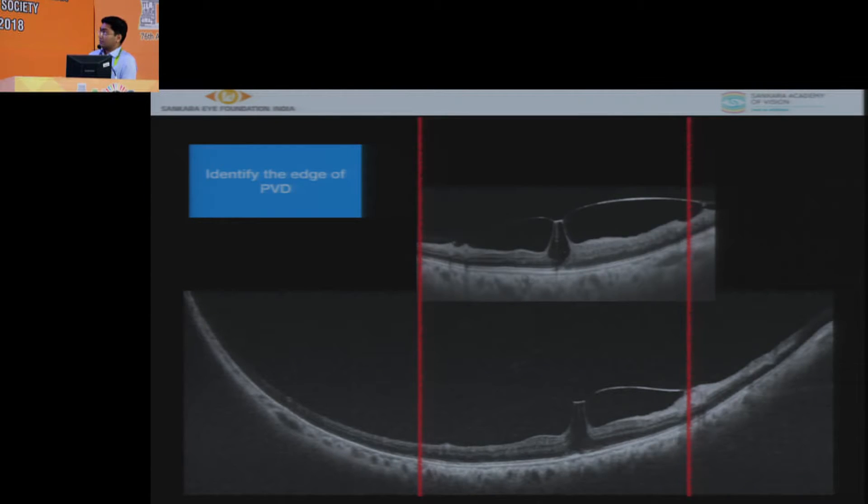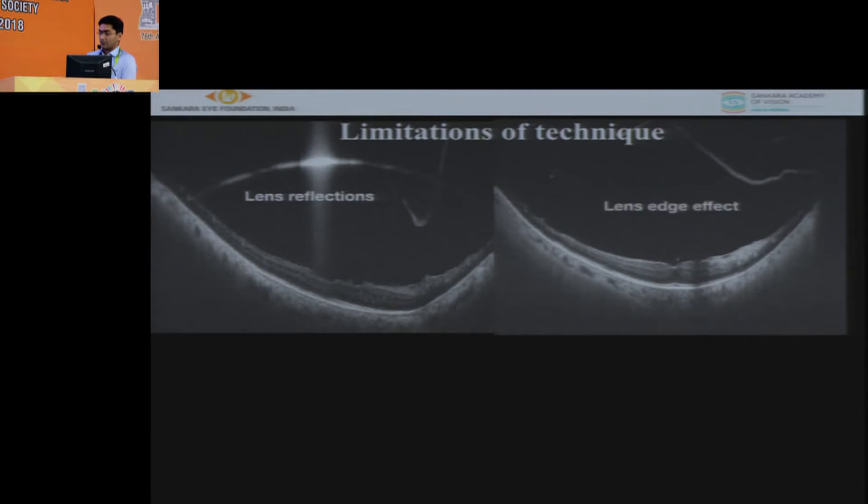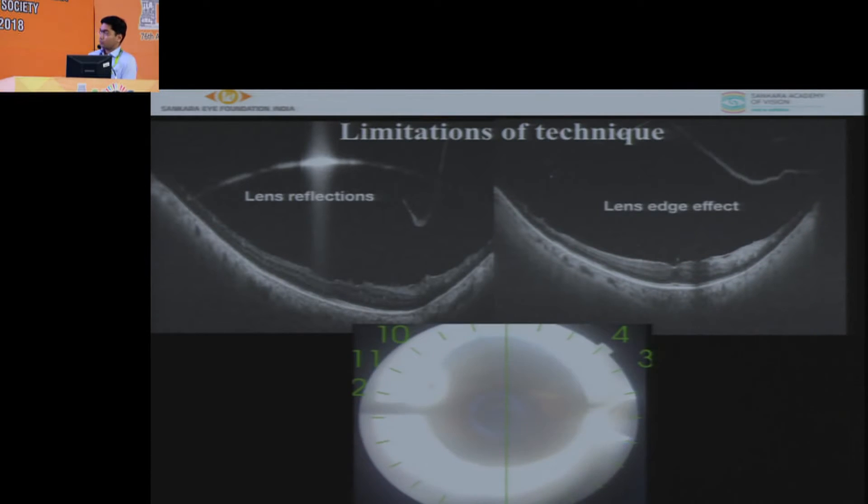And yes as you can see beautiful pictures of this VMD which right now we are seeing just this area with 12x12 and with using the 20-diopter lens it's so wide and beautiful colors with beautiful image quality. But yes it comes with some limitations - one is a lens reflection, another one is the lens edge effect and most importantly we have to go away with the poor fundus photograph.